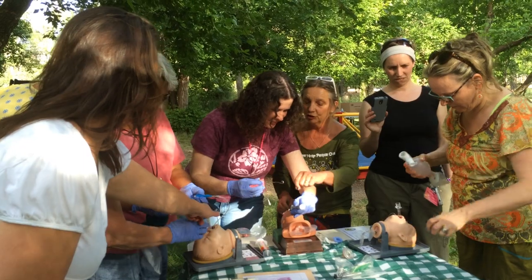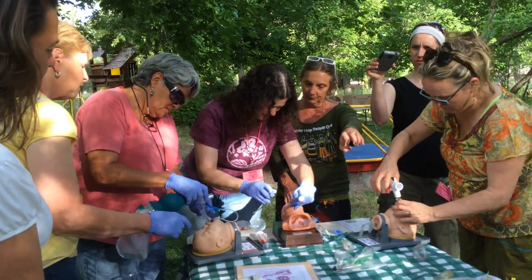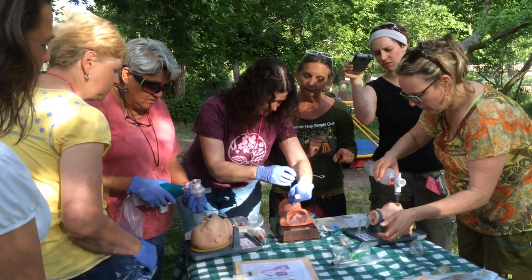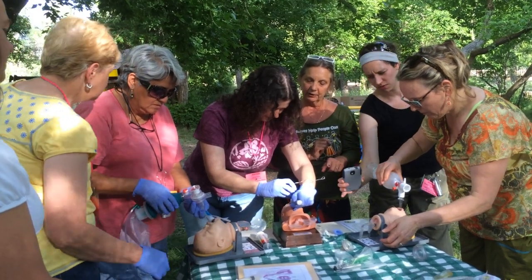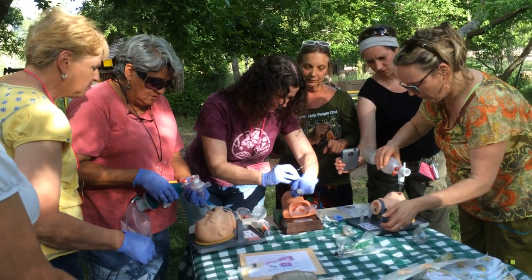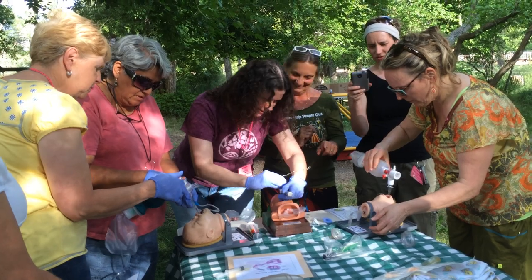So you just lift up the tongue, just like you did with your thumb. Can you see the two white lines in the black hole? That's where you aim for. You're doing great, Anne. Get that right in there. Go ahead, you got it. You can see it. I can see it moving.